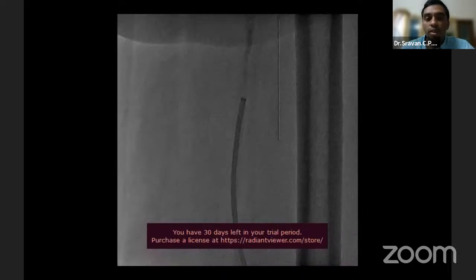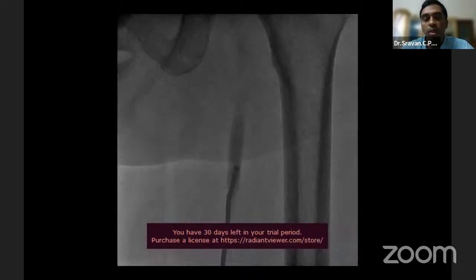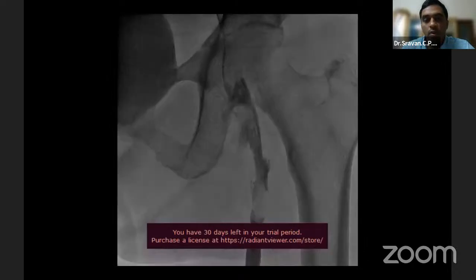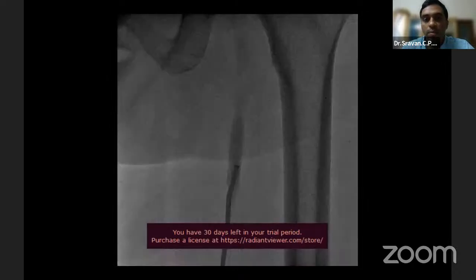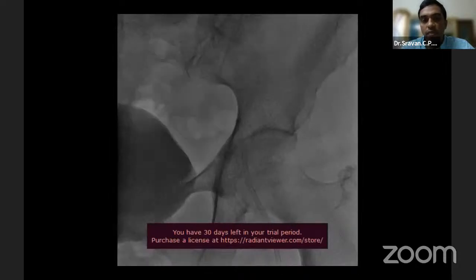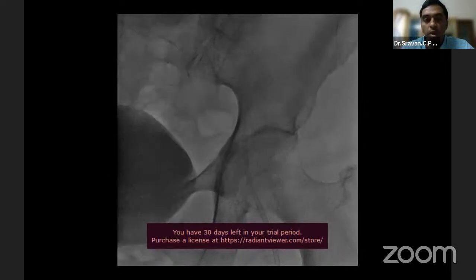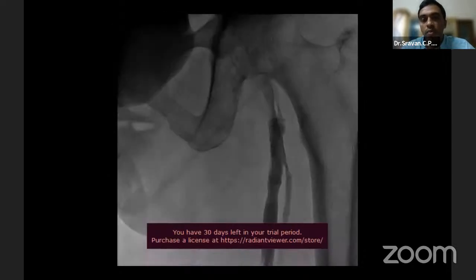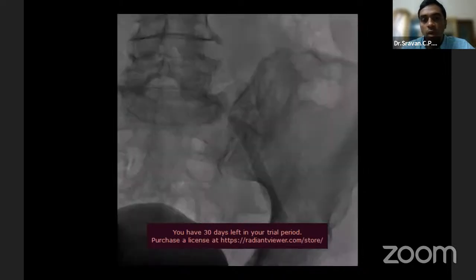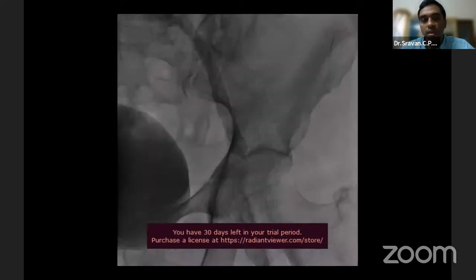After removing this segment, we saw a lot of chronic clots when we sucked out the catheter, and you can see that the chronic clots are clearly seen in that region. But after a good clearance in that region, we decided it's time to just balloon plasty that common femoral vein region, because we have a good amount of flow now, and the on-table opinion was to angioplasty that.